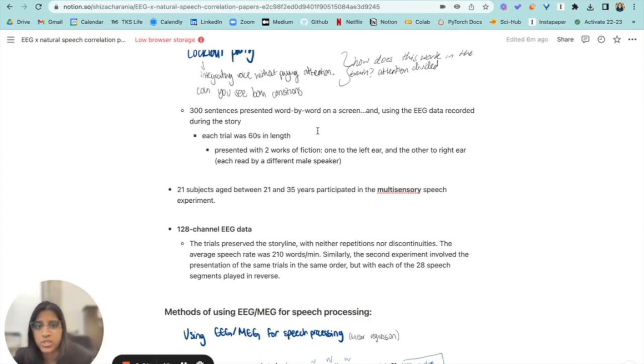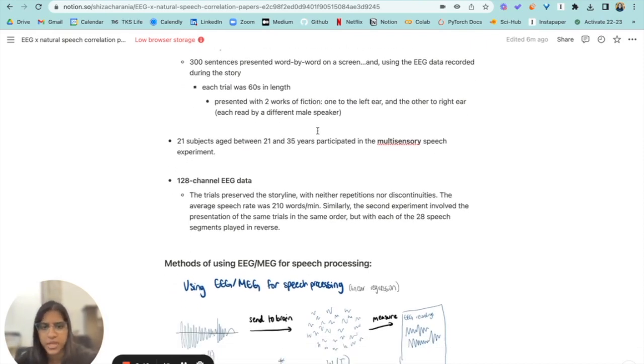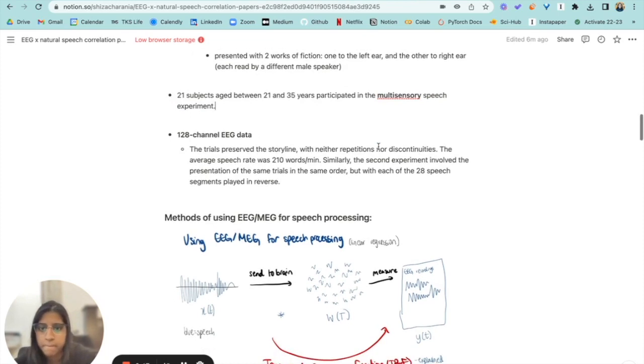There were also questions asked based on both these stories, just to see how the subject performed and how they listened to both of them. So that was another thing. There's also a multi-sensory speech experiment with 21 subjects, but I didn't go too deep into that.